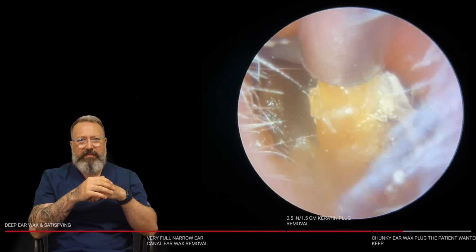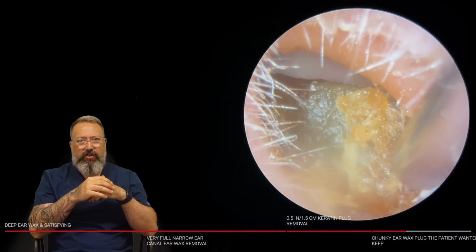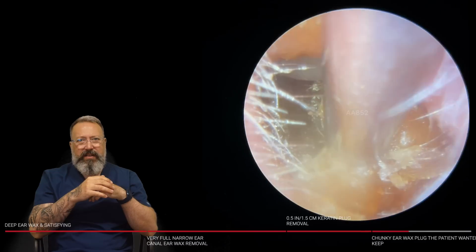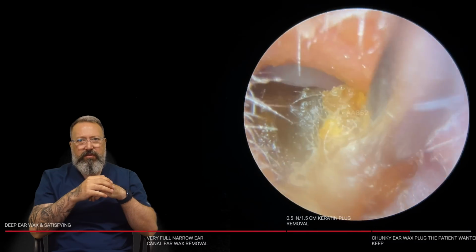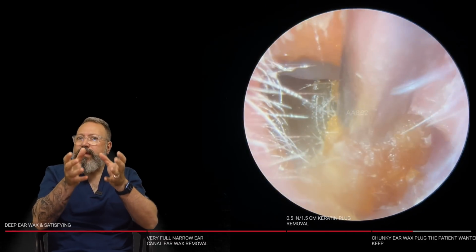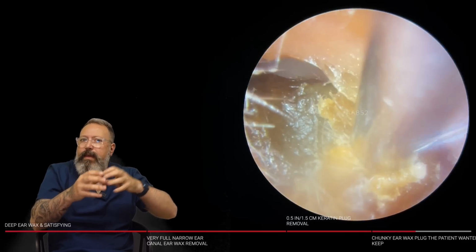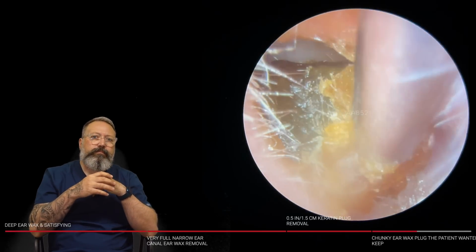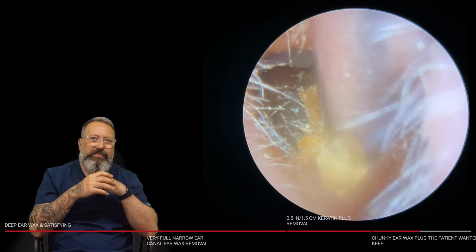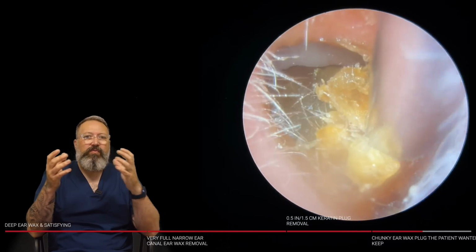We're just trying to lift some of these looser pieces off the side. Just going to put the standard size on the tube. If I can just get this a little bit looser, it's going to make it a bit easier if we do go in with a curettage tool. There we are. We can see that whole thing was just wiggling a little bit as we put a bit of pressure on it. It means the whole plug is starting to move a little bit there. There we are. But this is not going anywhere. It's just not budging at all. That's mobile, but it's just the wrong shape. It's not going to come out.